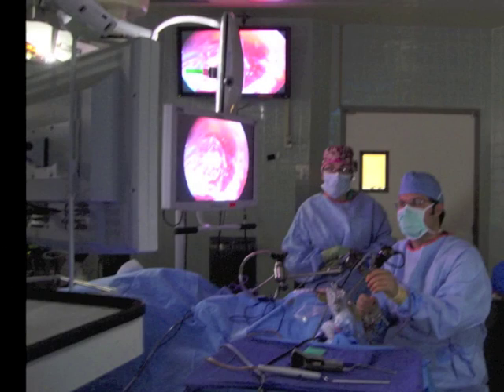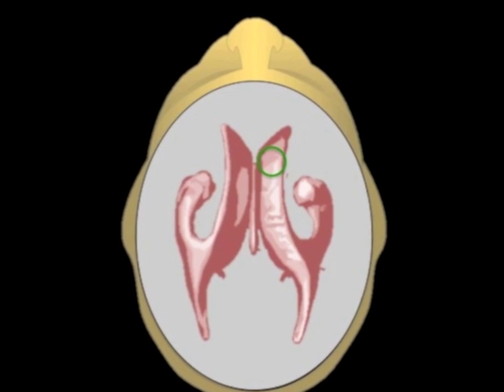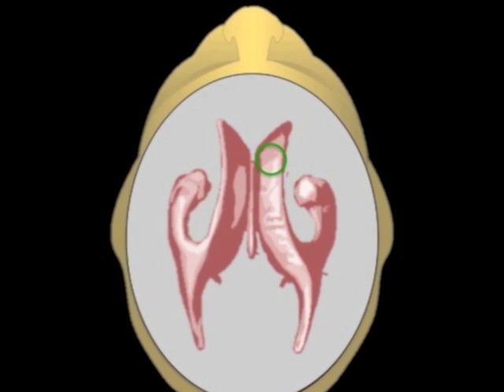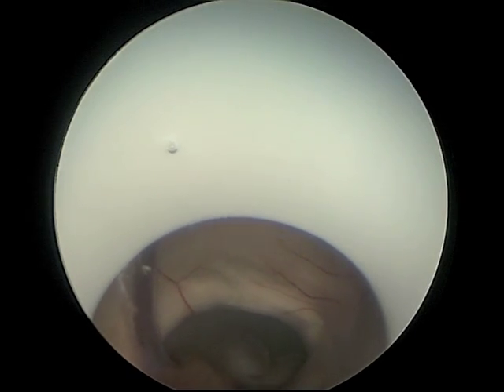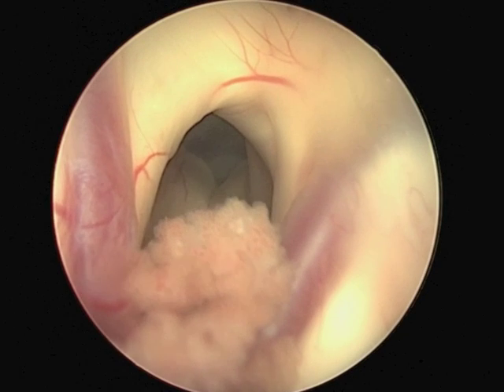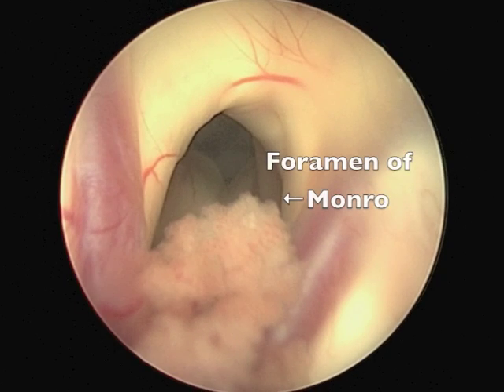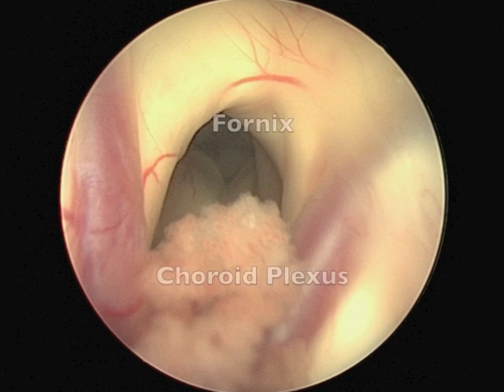The patient was brought to the operating room and positioned supine with the head in a Mayfield. A burr hole was performed on the right frontal area and the endoscope was advanced inside the right lateral ventricle. The ventricle was observed, and the fornix, choroid plexus, septal vein, and thalamostriate vein were identified.